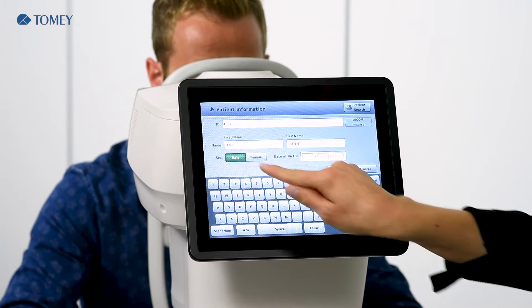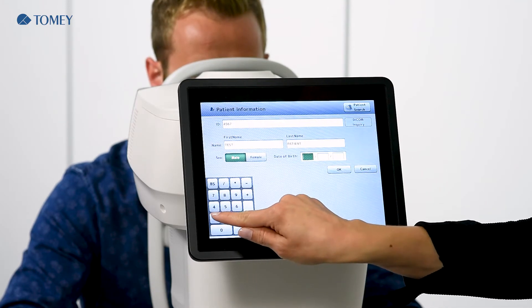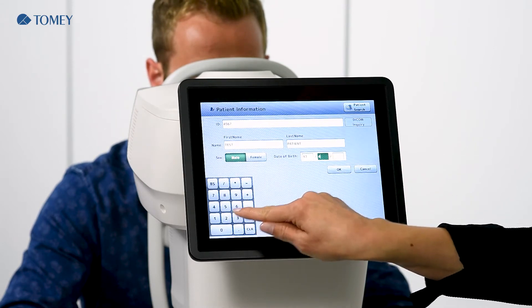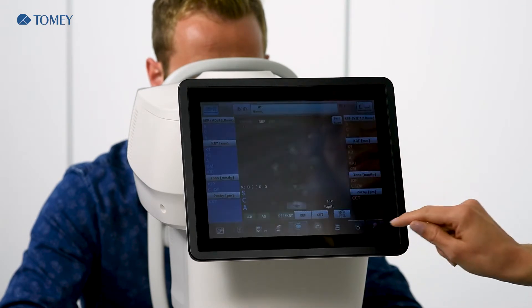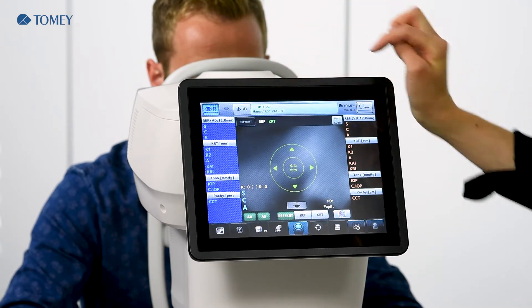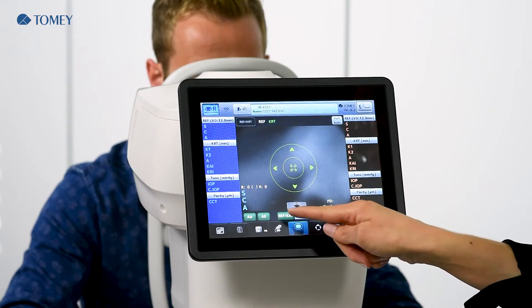He is a male patient with some random date of birth. After entering the patient, you will find this display and here in the top line you see which examination mode is activated. With the first startup, you always get into the REF and keratometer mode.